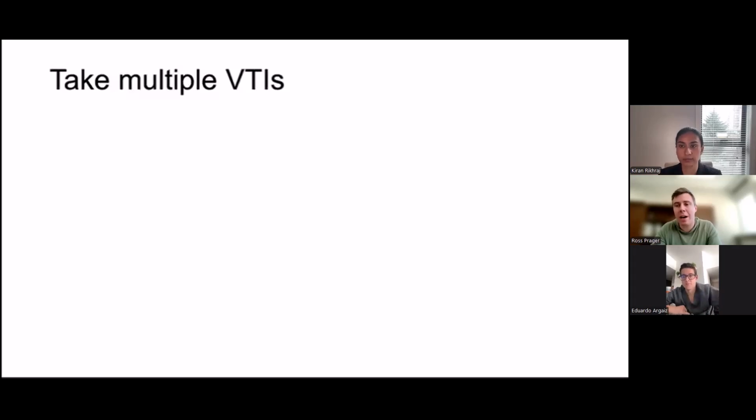To me, those are the same values. We're really looking for bigger trends, like a VTI going from 8 to 10 to 12 to 14, which is probably a significant change. Within 1 or 2, I typically don't view that as meaningful given the wide confidence intervals surrounding the exact value based on measurement error.